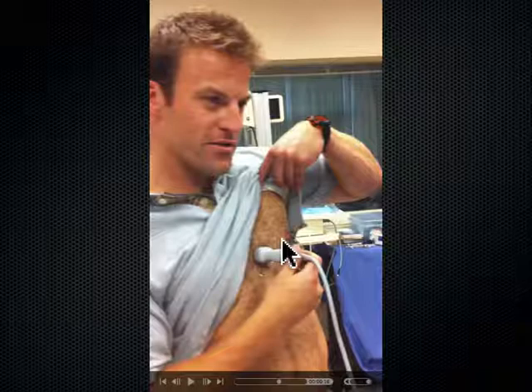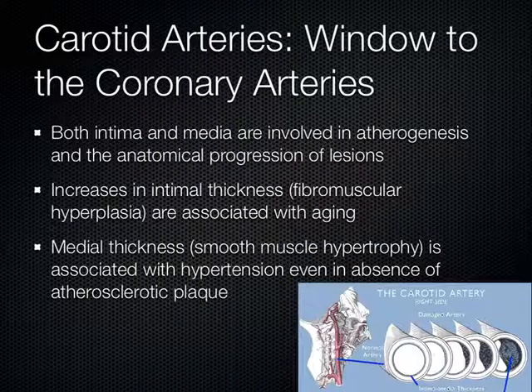This is why when we do this on patients, we lay them flat and roll them left lateral decubitus, and that makes the PMI somewhere over here. That's where you'd be putting the probe. I just wanted to point this out. He's a really good sport about stuff like that, so I'm sure he wouldn't mind that I stuck that up there. Any questions about that kind of stuff?